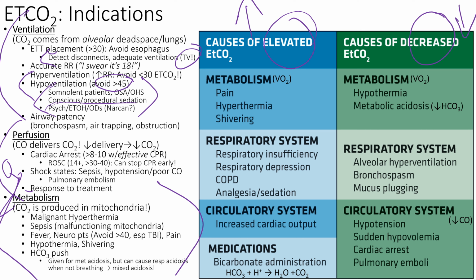It's like, yeah, they were snoring a minute ago. So you want to make sure we have the end-tidal CO2 for these guys as well. And airway patency, we can look at the monitor and see, oh, you got a bronchospasm happening. Let me get your breathing treatment, right? You can see if they have air trapping. You can see if there's an obstruction in the airways.